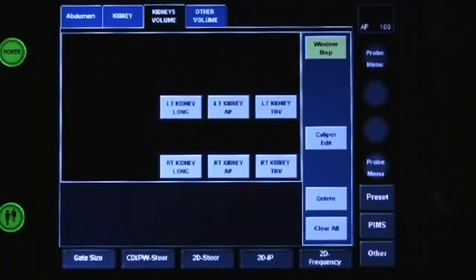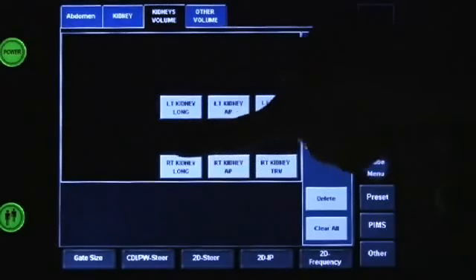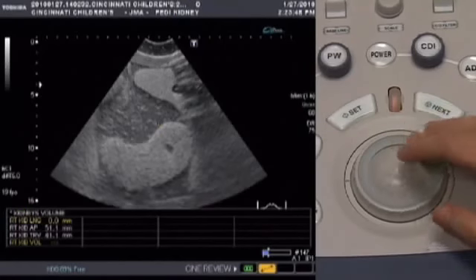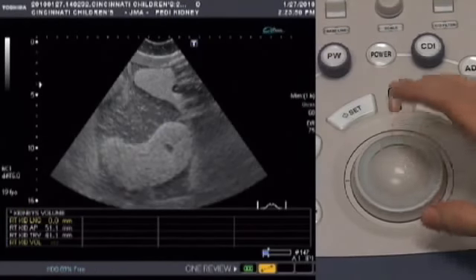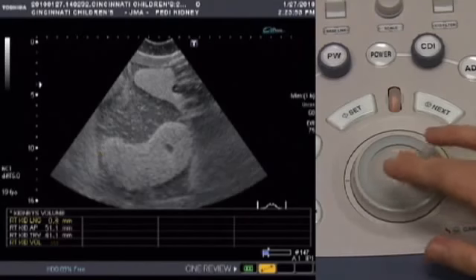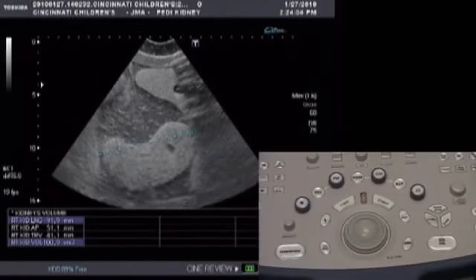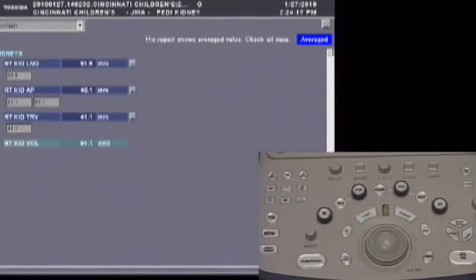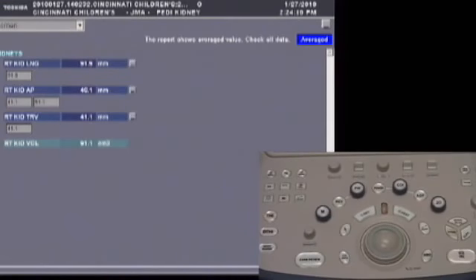Now we're going to measure the longitudinal axis of the right kidney — press that button on the touch screen. Using the trackball, move to one edge of the kidney and press set to mark it. Then go to the other edge using the trackball and press set again. We have now captured all three measurements of the kidney, so we're going to calculate the volume by pressing Report. You can also upload this image to PACS by pressing Store.